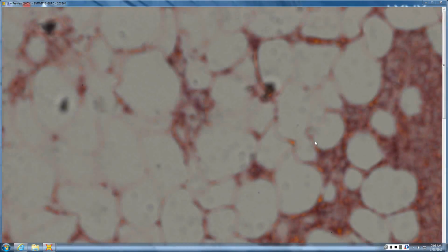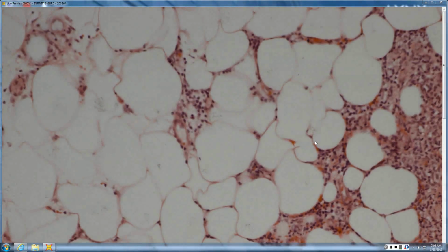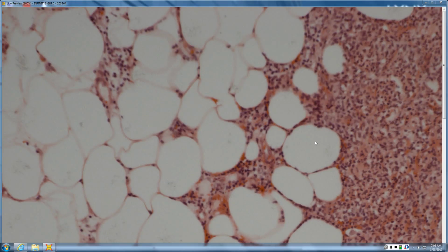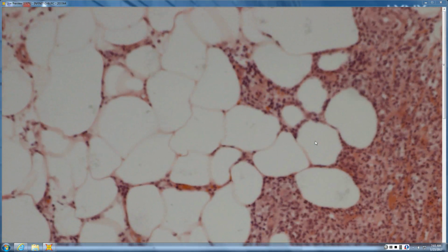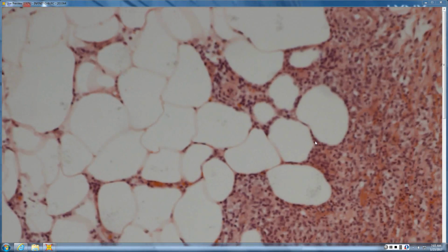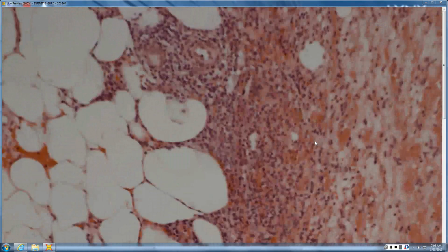And EN, the infiltrate, is going to vary depending on how acute it is. In acute EN, you're going to see more neutrophils, and then over time it's going to change to be more lymphohistiocytic. So when you have a neutrophilic variant, you want to make sure you rule out infection if you biopsy early EN. So this one to me looks like it has a mixture. I see neutrophils in there, I see lymphs, I see histiocytes. So kind of mixed inflammation, especially at the dermal subcutaneous junction here.